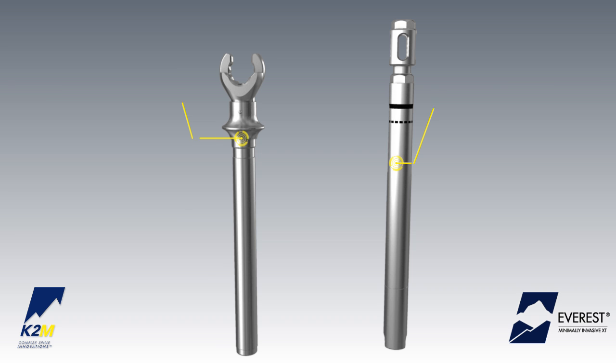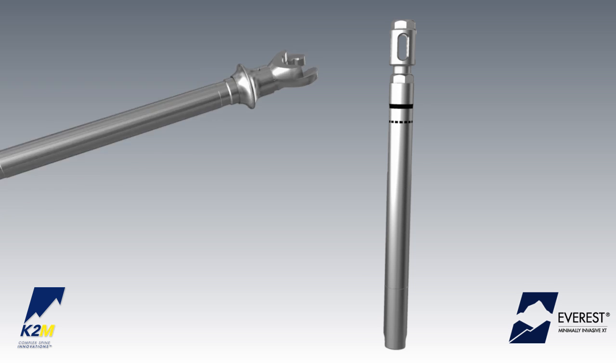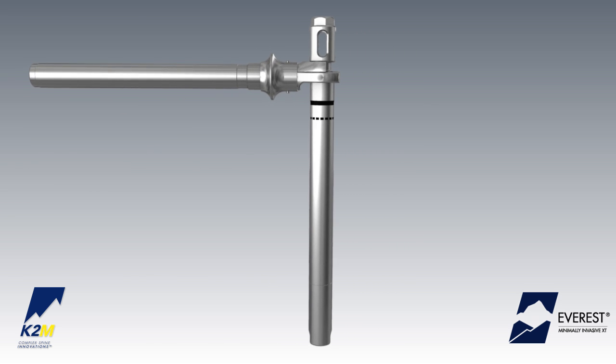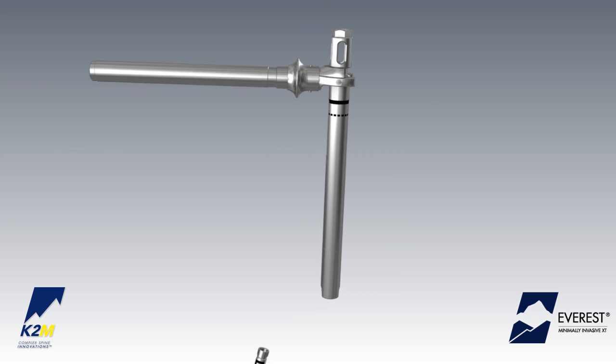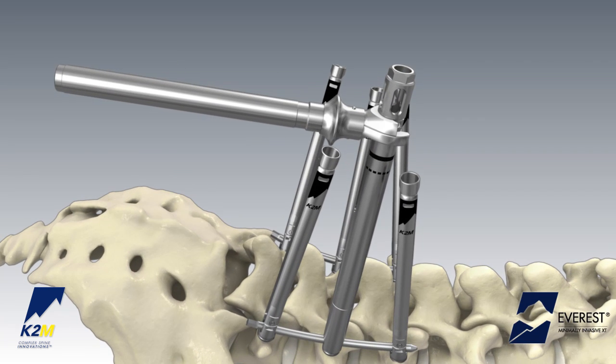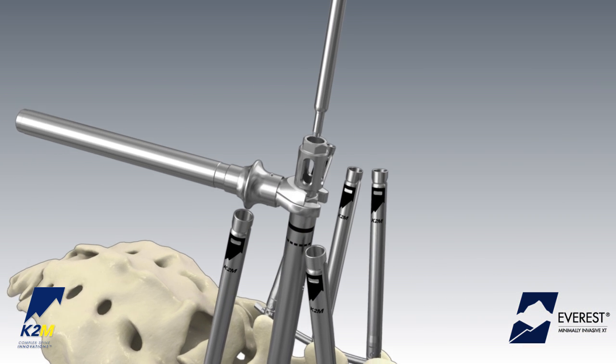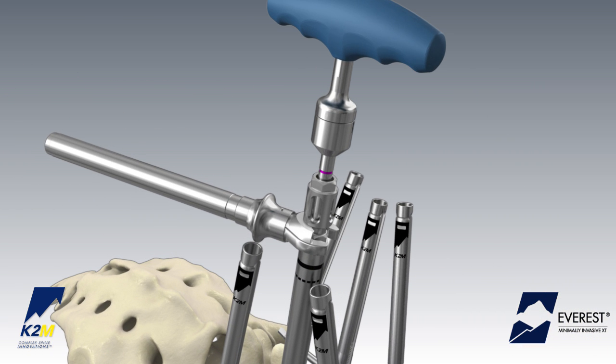In addition to the tab reduction tunnel, final tightening may also be achieved by using the anti-torque handle and the stabilization tube. Attach the anti-torque handle to the stabilization tube and slide the stabilization tube over the extension tabs until it is fully seated over the XT screw. External markings indicate proper alignment. Insert the torque-indicating wrench into the cannula of the stabilization tube to complete the final tightening.